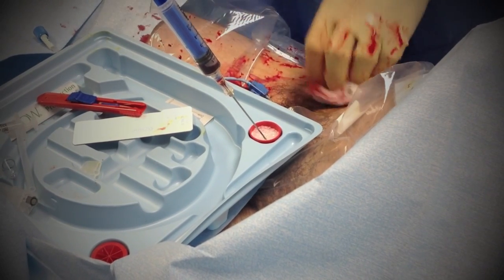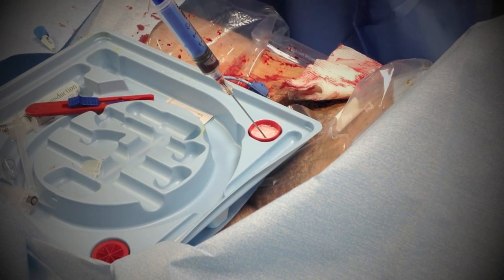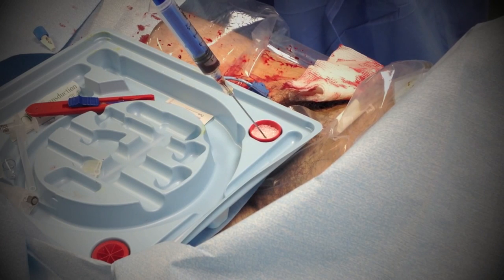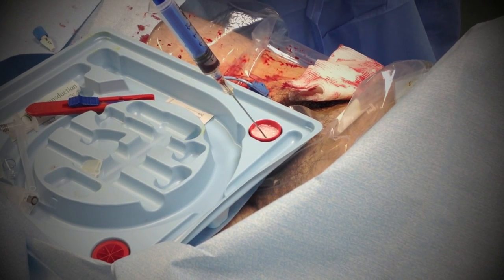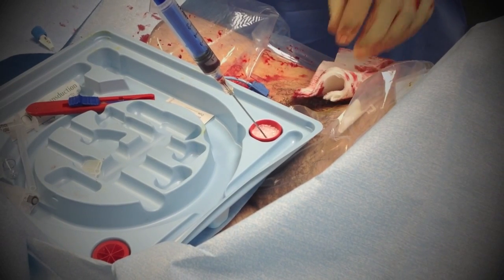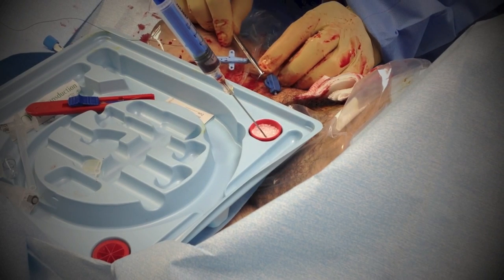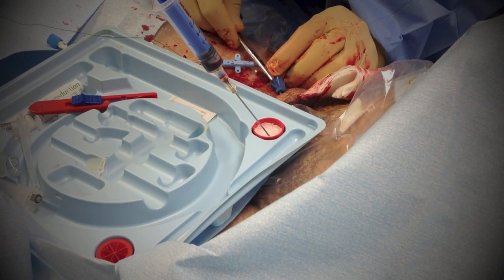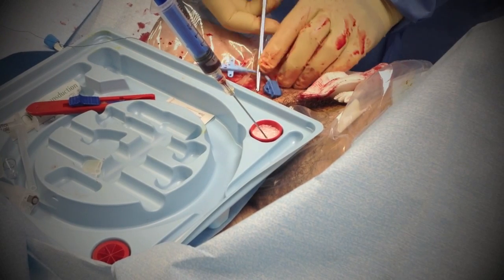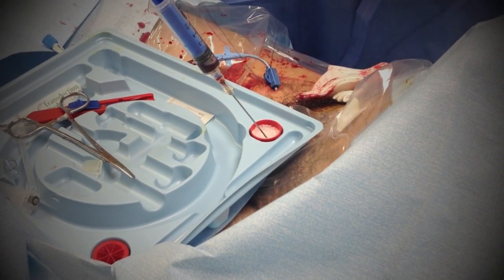So we're good. We're about to fix it to the skin so the line doesn't move and come out of place. You have those flushes for me, and the caps? So this you might actually feel — I need to suture it to the skin, and then I just use a one-handed technique to tie it.